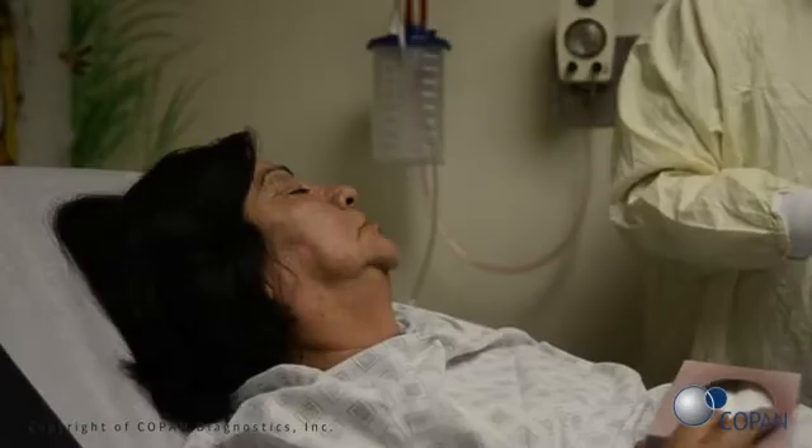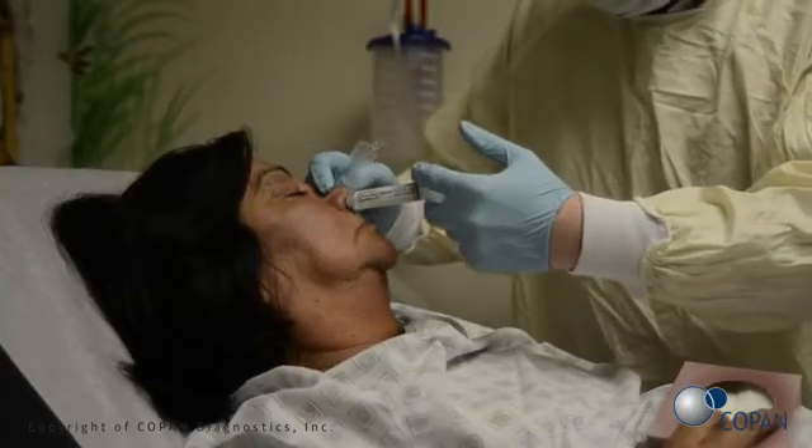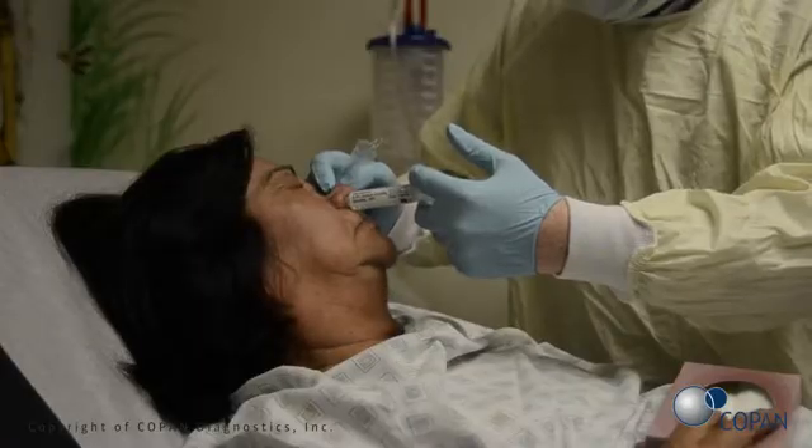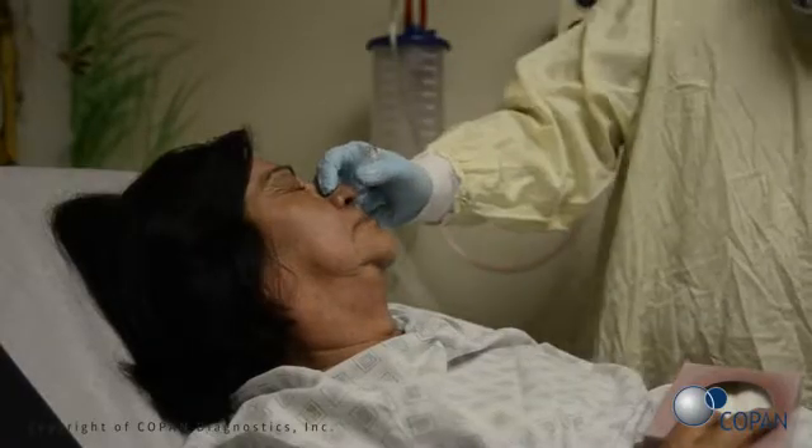Have the patient lay down with their head tilted back and neck extended to allow for the pooling of the aspirate in the nasopharynx. Instruct the patient to hold their breath and not to swallow during the procedure.